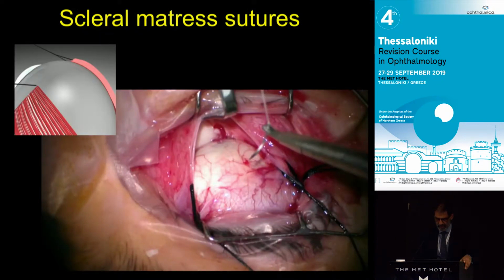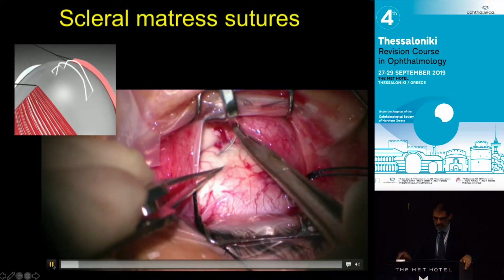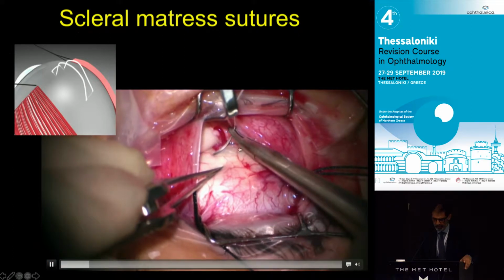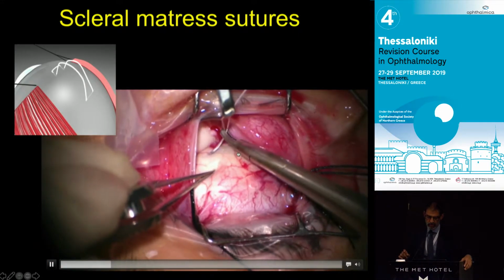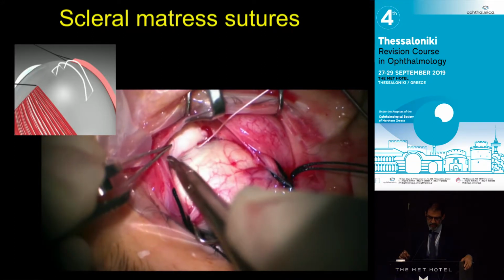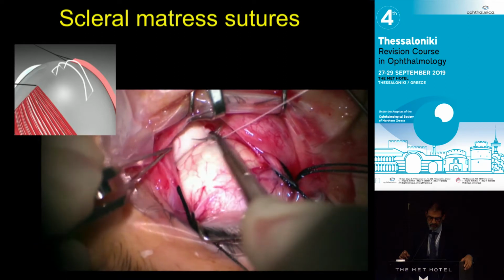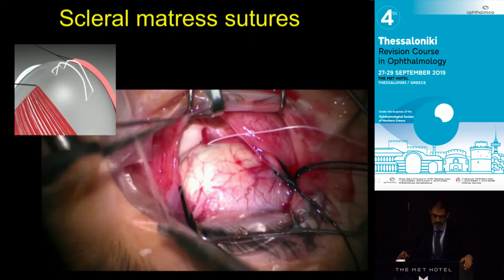The next thing is to put in the sutures. So a few things: we measure it, and then you look out for the vortex vein, which is almost always exactly where you want to put your stitch, but nonetheless, that's life. A nice deep bite there, and this is going to hold and pull the buckle in place.